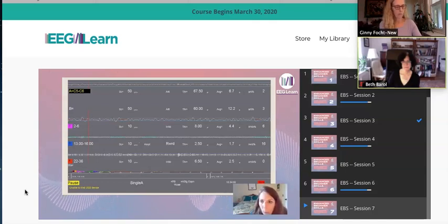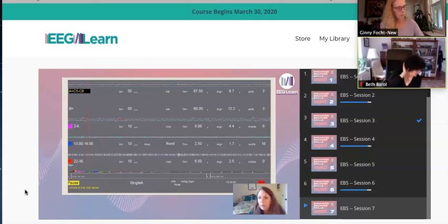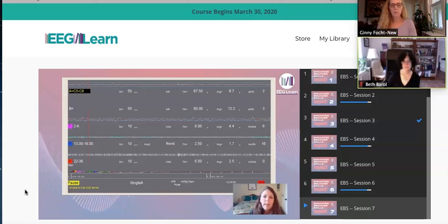Even though this is a bipolar protocol, I would still use that coaching strategy to say, see if you can have a calm external focus. That means, if you notice you've been caught up, really wrapped up in following one thought for a pretty long time, we just want to drop it and shift your focus out to something you're seeing or hearing in the environment around you, right? And then if they're doing that, hopefully this average amplitude of what we're rewarding is going to increase.